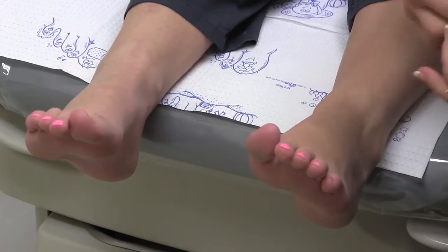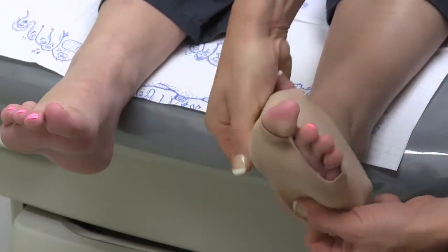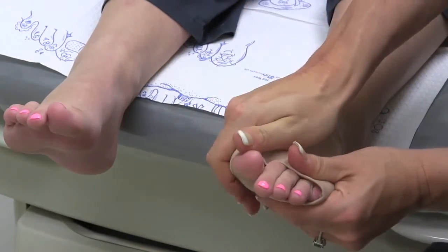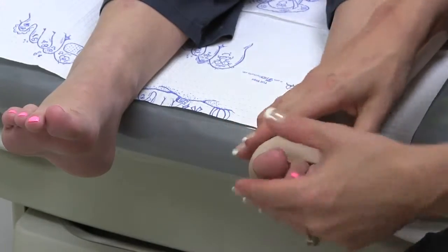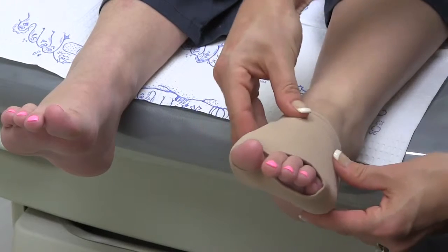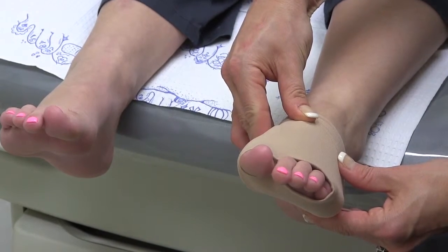What you're going to do is just pull the opening and then slide it between the big toe and second toe down on the foot. Make sure that you remove this at night to allow the foot to breathe. The gel pad is positioned on the bunion and the sleeve is slightly compressive, which is perfect for after bunion surgery.